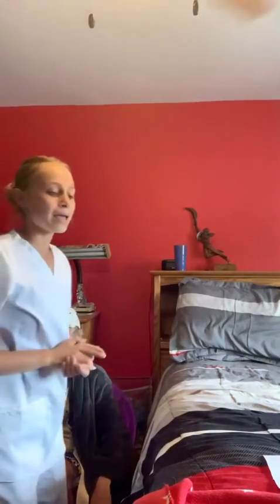Okay, and that is how you do it. So after you have transferred your patient from his bed to his wheelchair, just provide for comfort, make sure the call light is within their reach or any other items. Also, just do a safety check around the room, and then wash your hands, and then just record and report any observations to the nurse. And that is how you transfer your patient from his bed to a wheelchair.